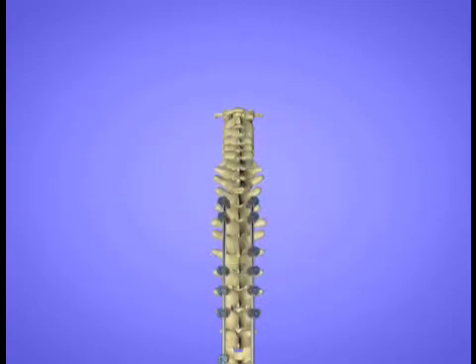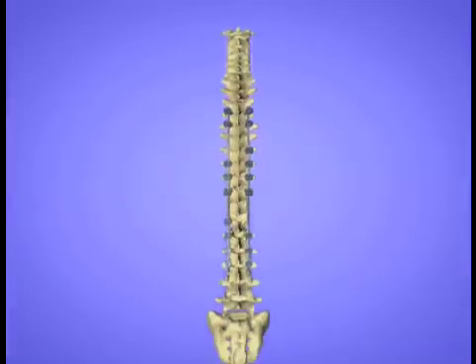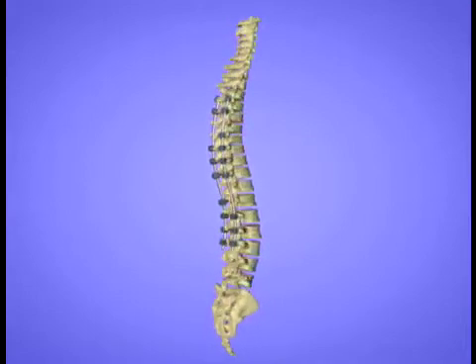All of the instruments are removed. This completes our three-dimensional scoliosis correction.